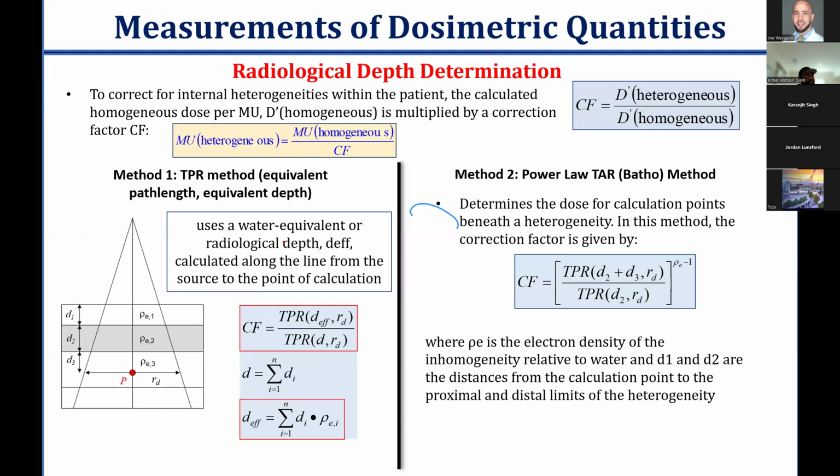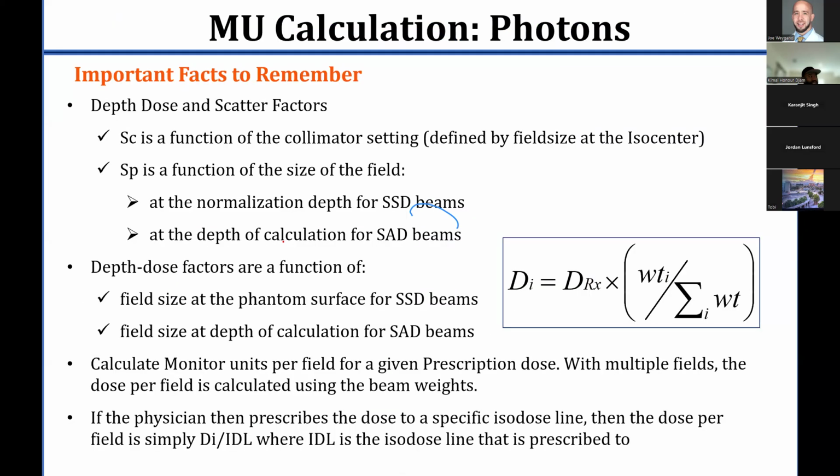And the concept of radiological depth determination, which really is important. Now, before we do, let's dive deep into some examples. We have about 10, 15 minutes. Before we do examples, there are a couple of important facts to remember here.